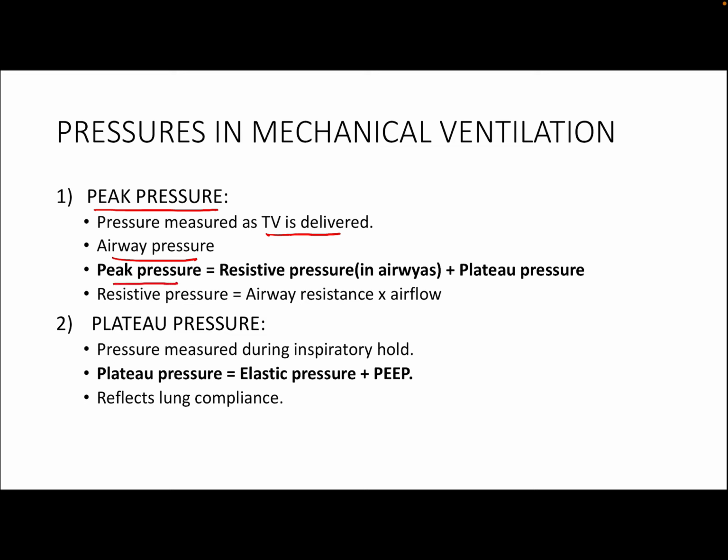Peak pressure is equal to the resistive pressure, which is the pressure in the airways, plus the plateau pressure, about which I'll be talking about in a second. And this resistive pressure in the airway can further be formulated as airway resistance into the airflow. So this is the peak pressure, essentially the pressure that is measured as we are delivering the tidal volume.